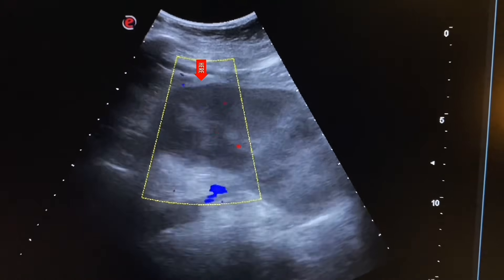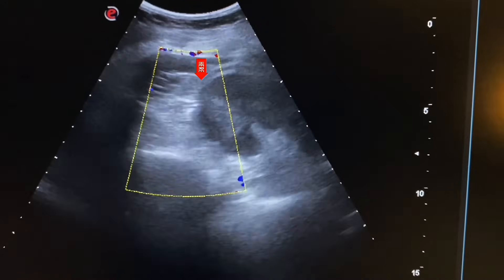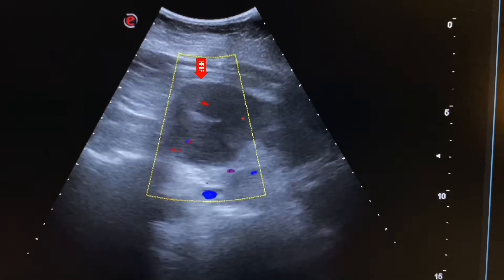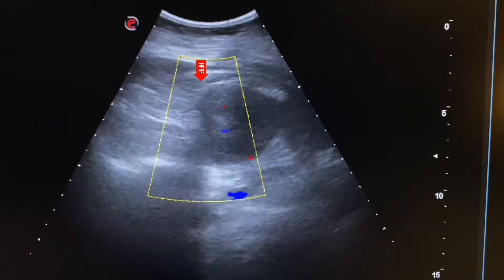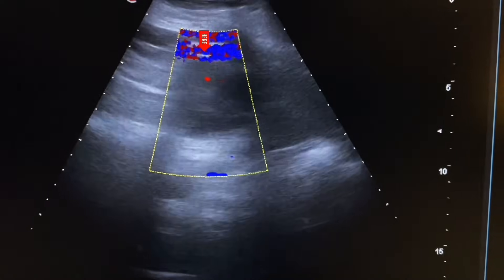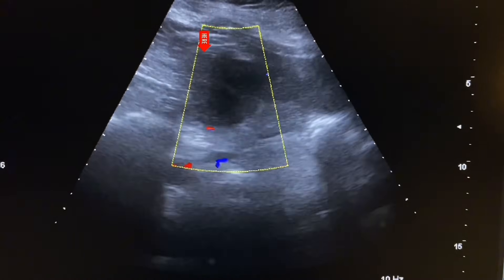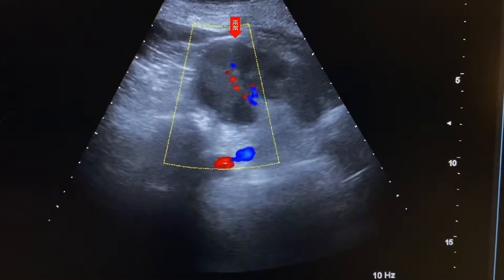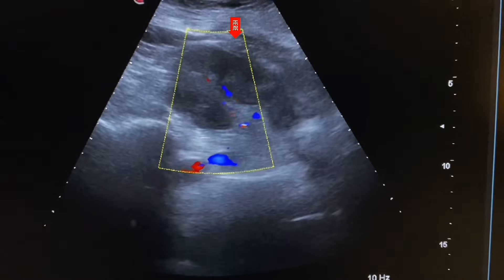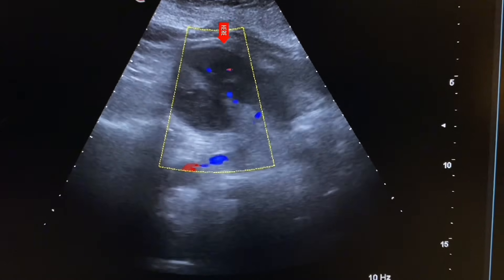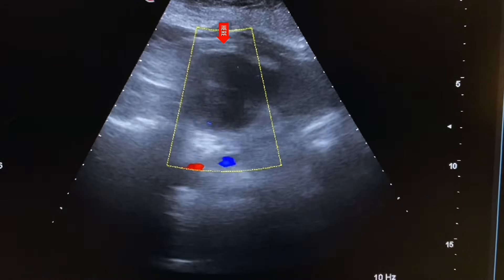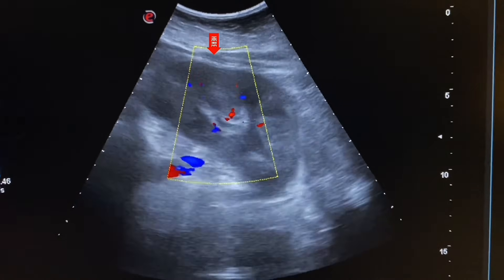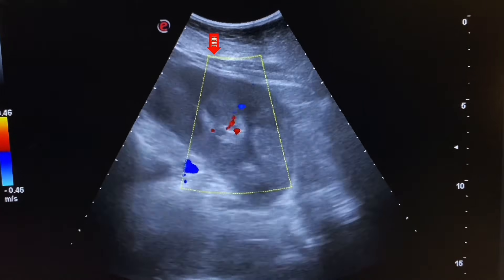Now we will check the flow in the focal lesion using Doppler. Here we see flow in the focal lesion — increased flow is noted in the focal lesion. The margins of these focal lesions are not clear. They are diffusely located in the cortex of the kidney.